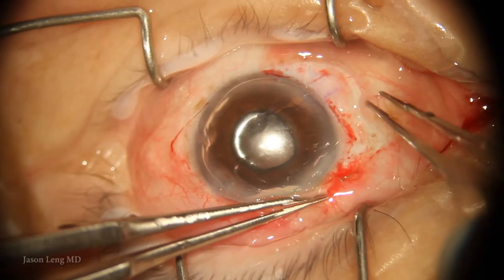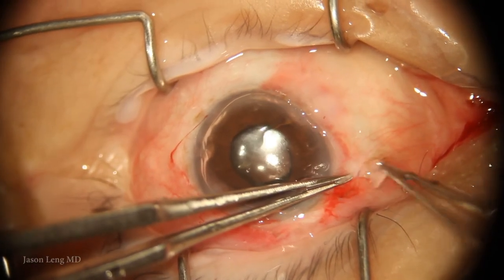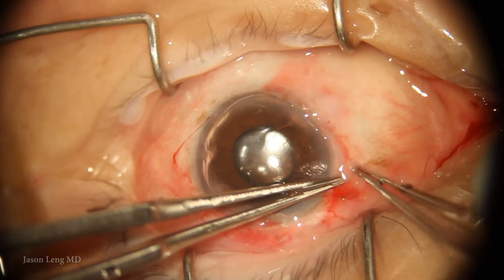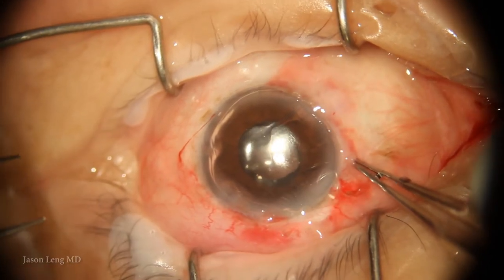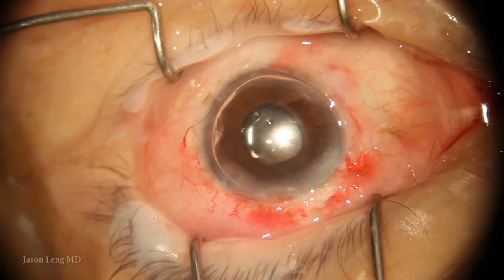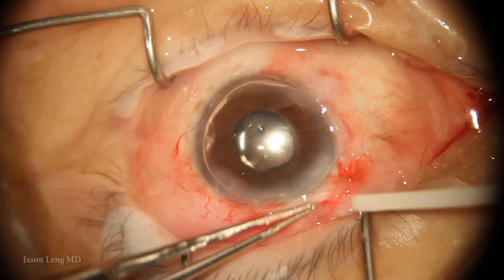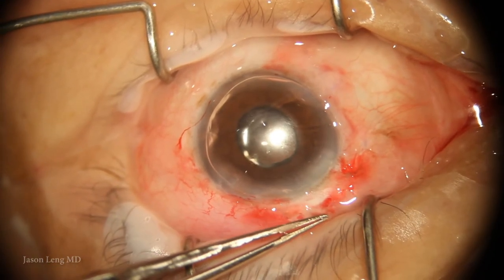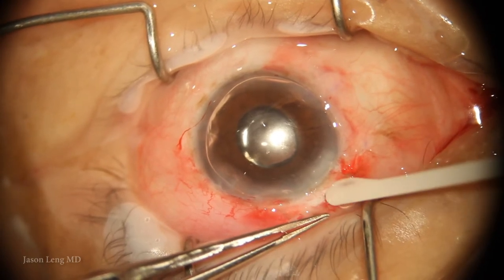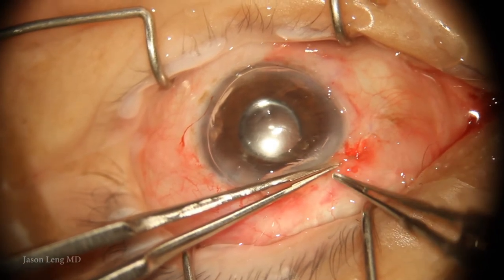I pull the conjunctiva together — you can do this all in one sweep. If there is any extra glue, I trim it away with scissors, because you don't want to pull on the glue as the whole sheet can pull out. I add a little extra glue to make the conjunctiva cover the incision a bit better.